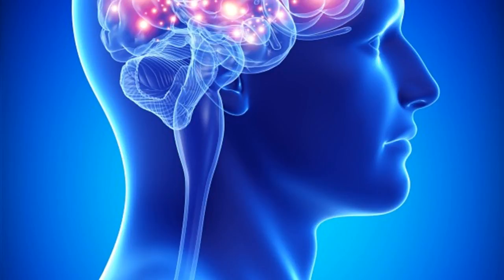What we do is functional MRI. So we want to know what's happening over time, what's changing over time. And the thing that we're mostly interested in is blood flow. So in one case, you're taking a snapshot, and in your fMRI, you're watching it progress. Yes, we scan individuals over the course of, say, 5 to 10 minutes, and we can see which areas of the brain become activated, have more blood going to those areas over the course of an experiment.